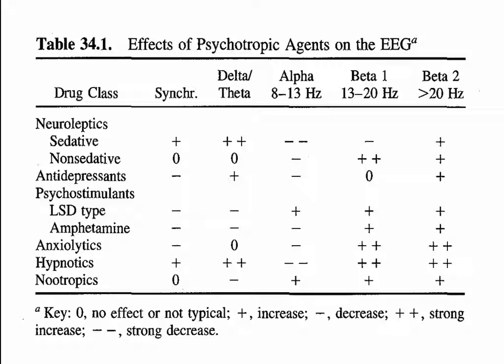And so in the posterior rhythm, we see a great deal of synchronization. A lot of neurons are firing together in the same frequency, and this causes a very synchronous waveform pattern. Now when you open your eyes and start processing incoming visual information, that synchronization goes away, and you have what is typically called a desynchronized EEG.